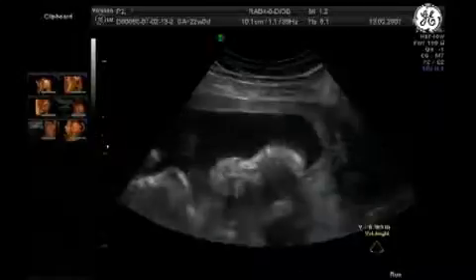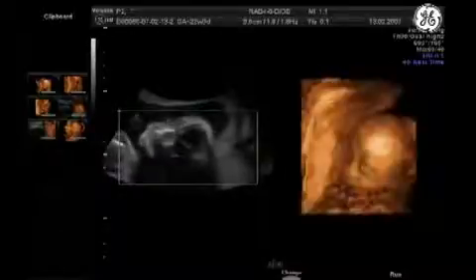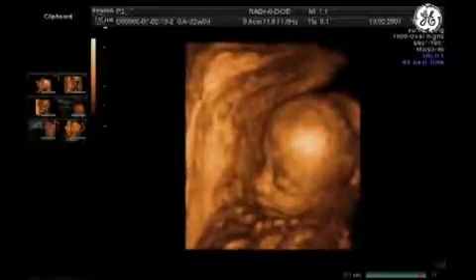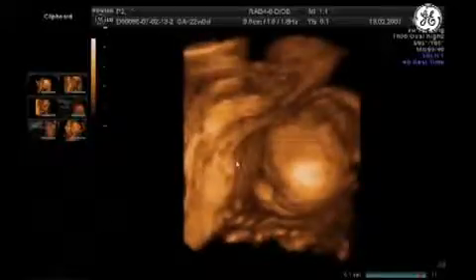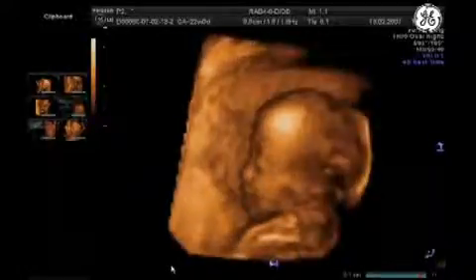Now I think the position is better. Okay. Use a magic cut. Remove the cord. Profile.